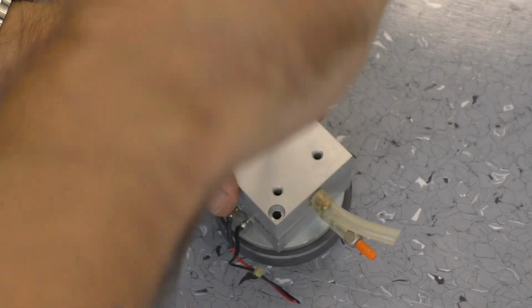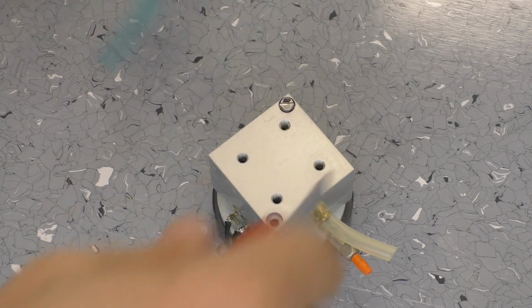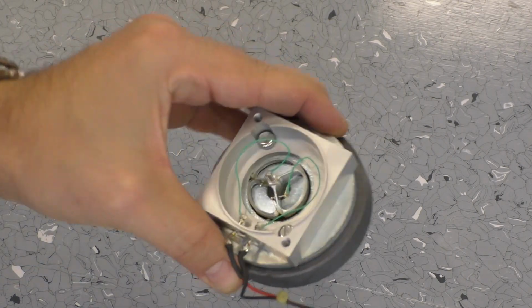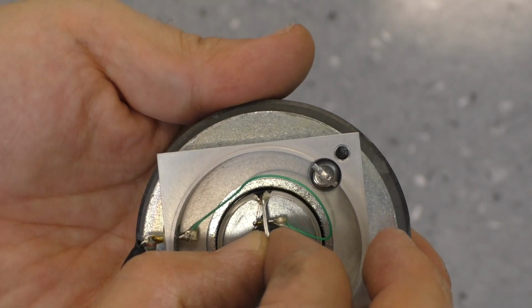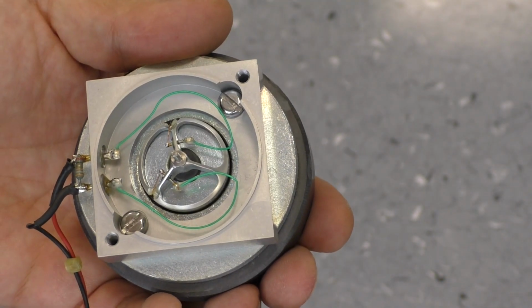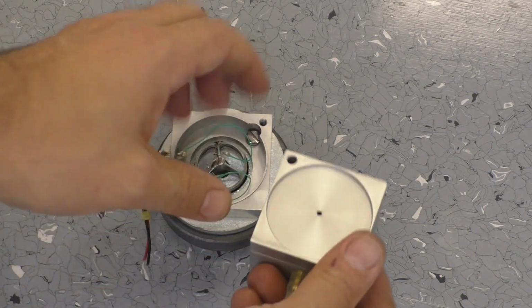Some people call me a vandal with a screwdriver, but that's not true. I have pliers too. So, I think that's coming apart now. Oops. There is, ooh, something nice. Looks like a rotating device. Okay, there's not much here. Oops. Okay.